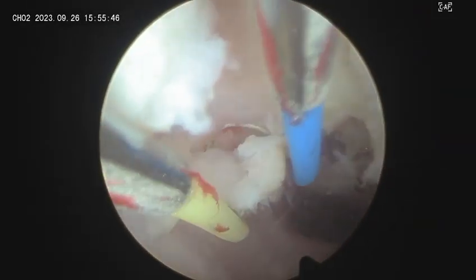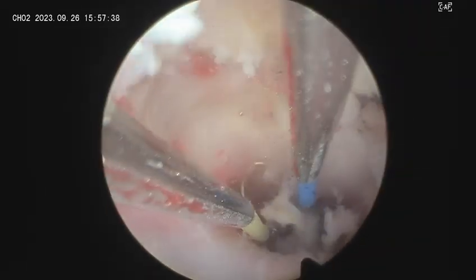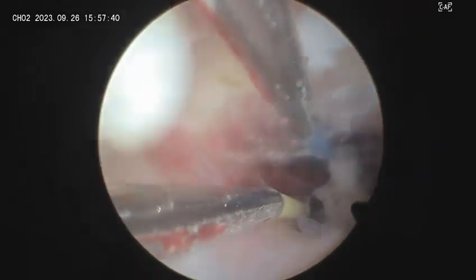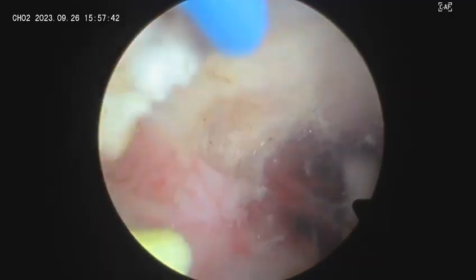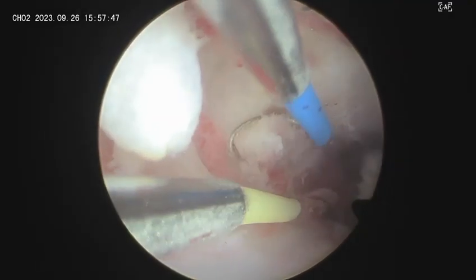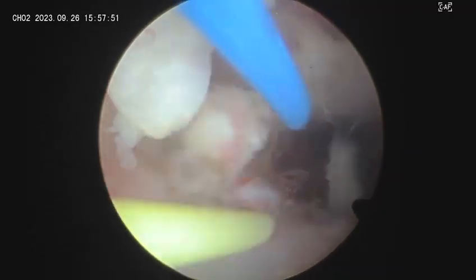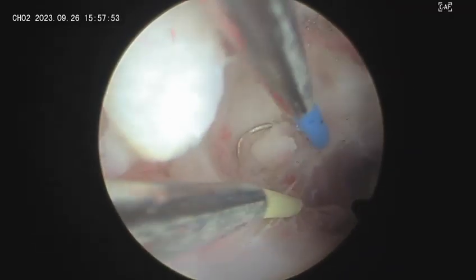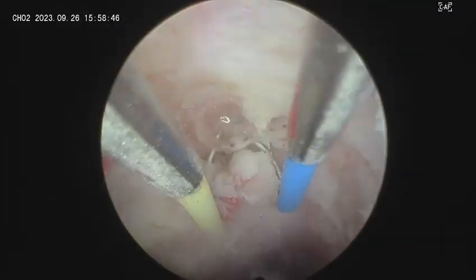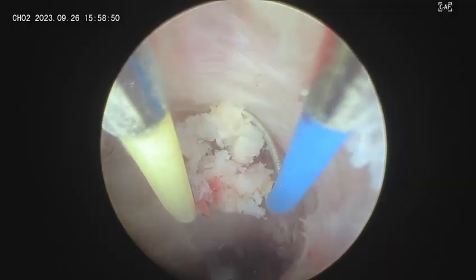And also the hysteroscopic repairs have been very effective in abnormal uterine bleeding, but there have not been enough studies for secondary infertility with this kind of abnormal uterine bleeding. However, we have had 2 pregnancies with hysteroscopic repair of the isthmoscele, and their delivery is awaited.